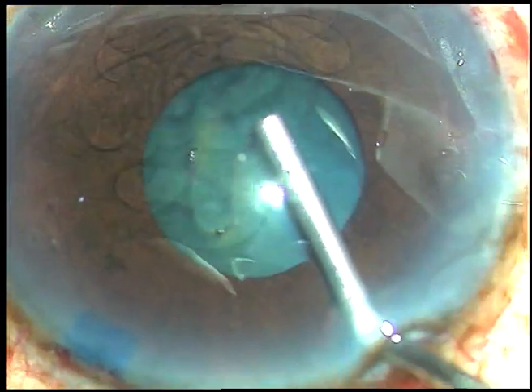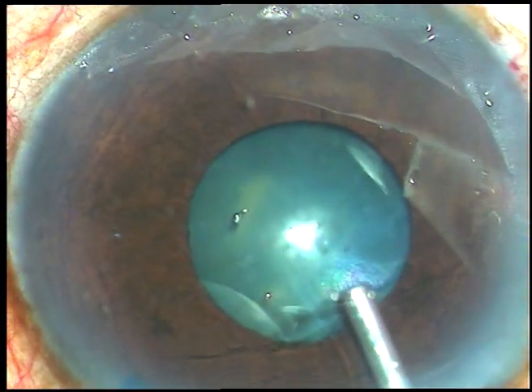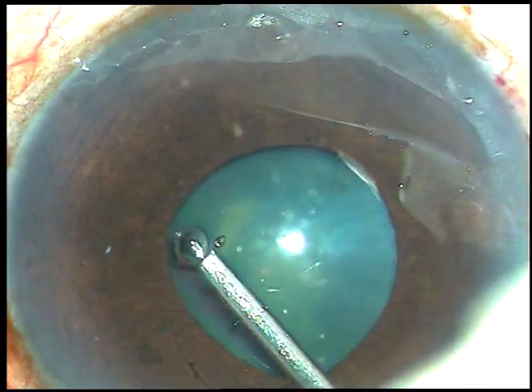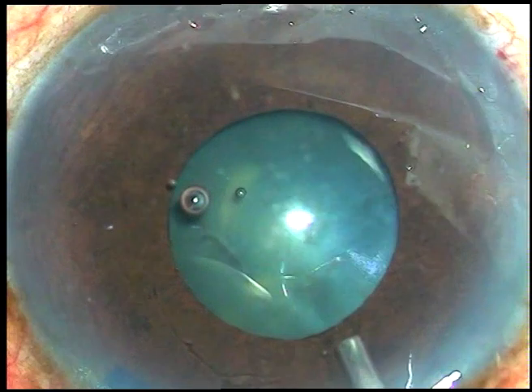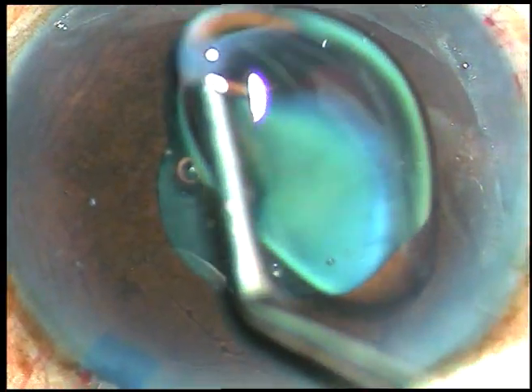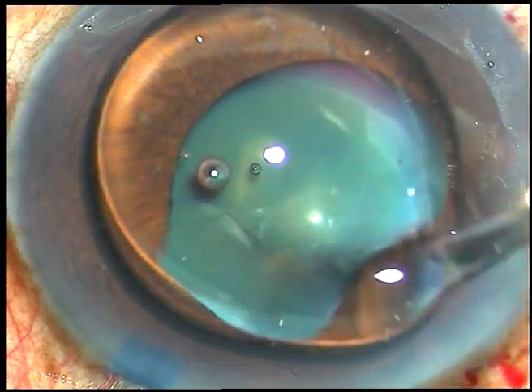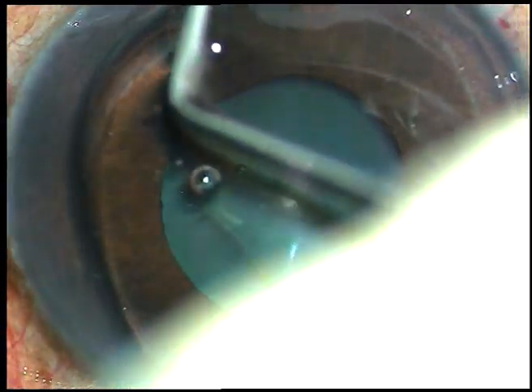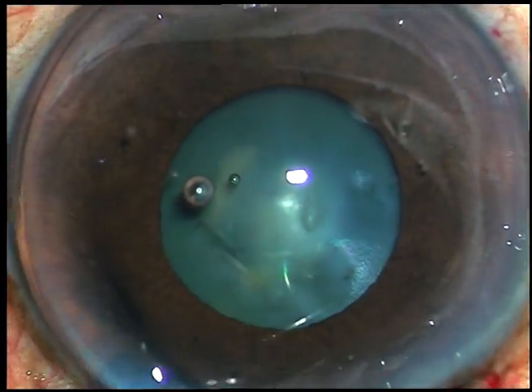Adrenalin has no effect in this case. So I have decided to use B-hex pupil expansion device, and I have already asked for it. Now the anterior chamber is underfilled and a little bit of viscoelastic is injected underneath the iris to make some room for the flanges to be tucked.